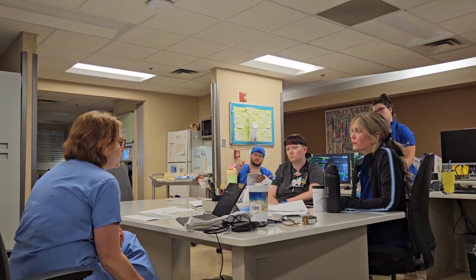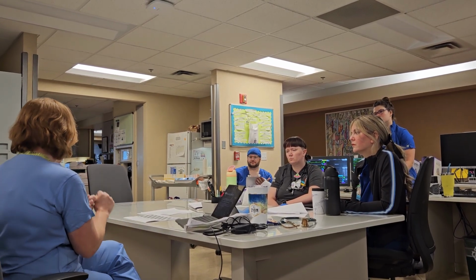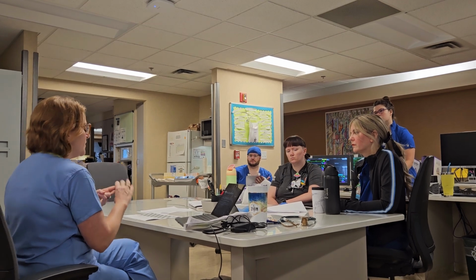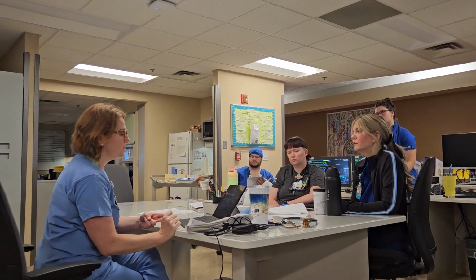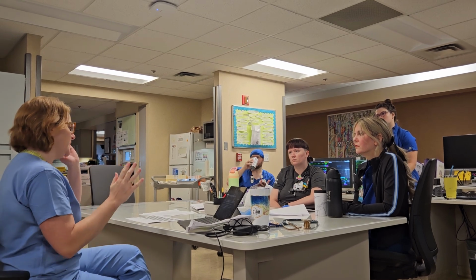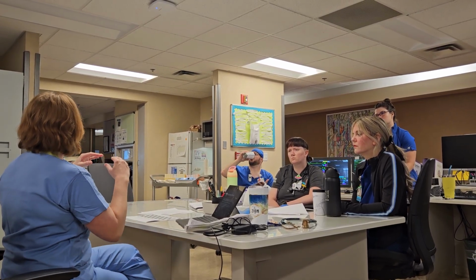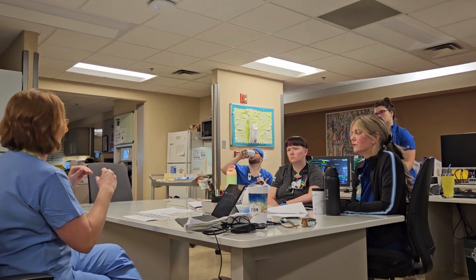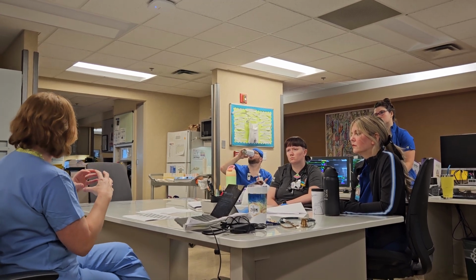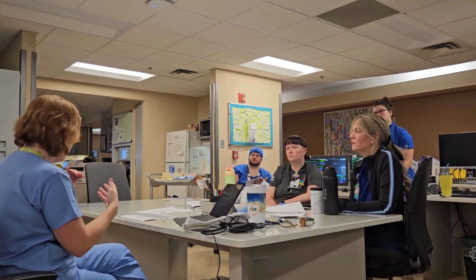Oftentimes we're using pressure control because there's either poor lung compliance and we want to really control airway pressures, or as an alternative to volume control because vent dyssynchrony is a challenge and we don't necessarily want to be forcing a breath in if somebody is very dyssynchronous with the ventilator breaths that we're giving them.